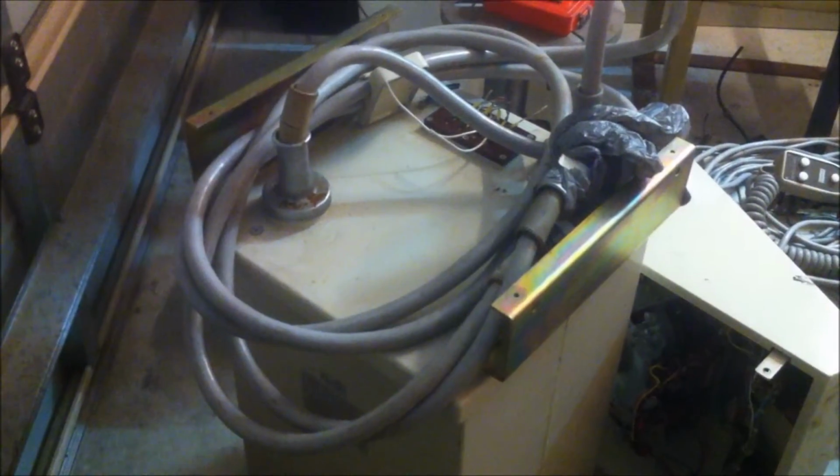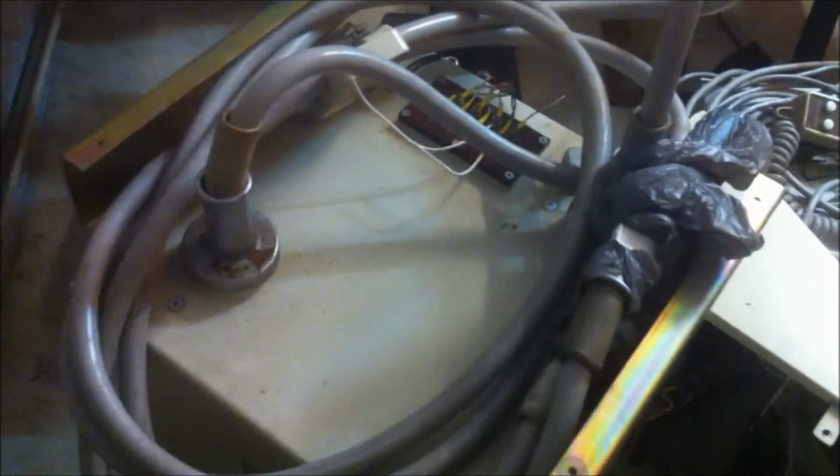Pretty cool. Now, tucked away in the dark corner of my garage here, I've got my new X-ray transformer. It puts out 100 kV. So you can see the negative terminal there and the positive terminal of the high voltage there. Now, these fittings are in relatively good condition, bit of surface rust, apart from this crack here in this strain relief insulator here, so I'll probably replace that, but apart from that the whole thing looks to be in fairly good condition. Just a bit of surface rust on these fittings. The whole thing needs a bit of a dusting, but that's about it.